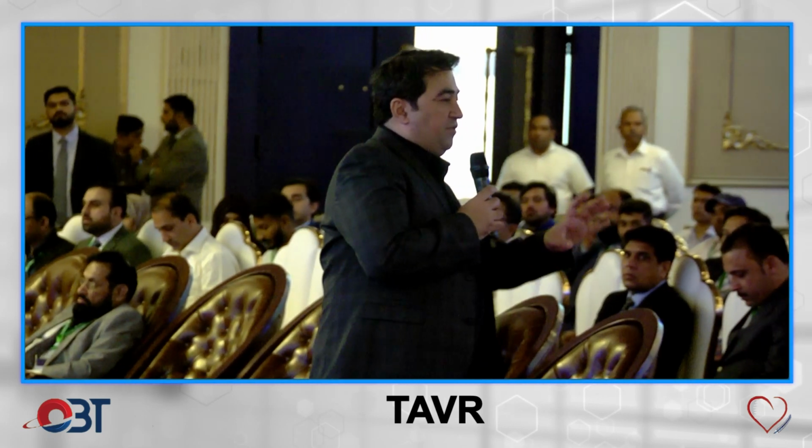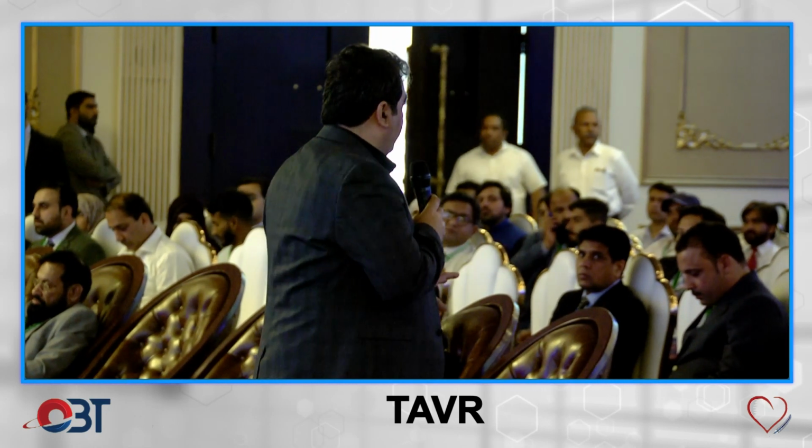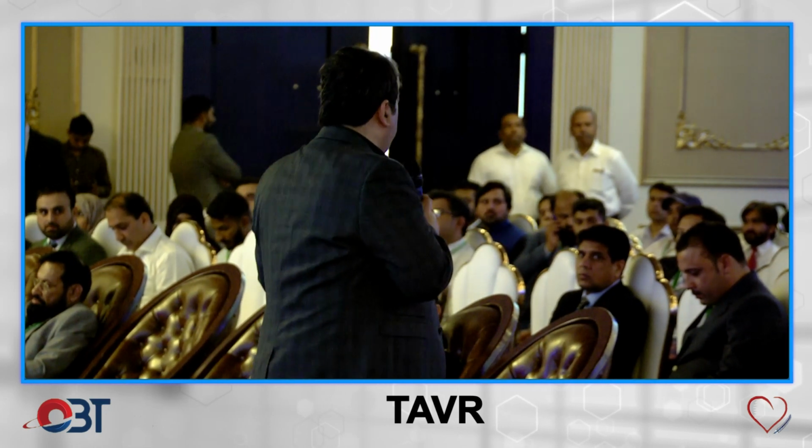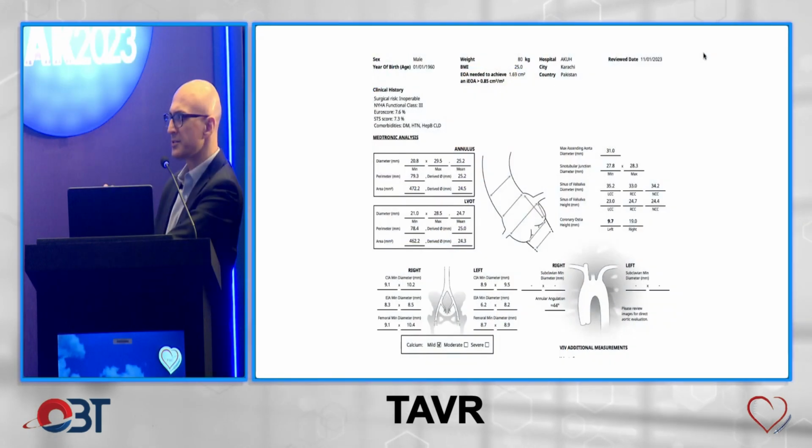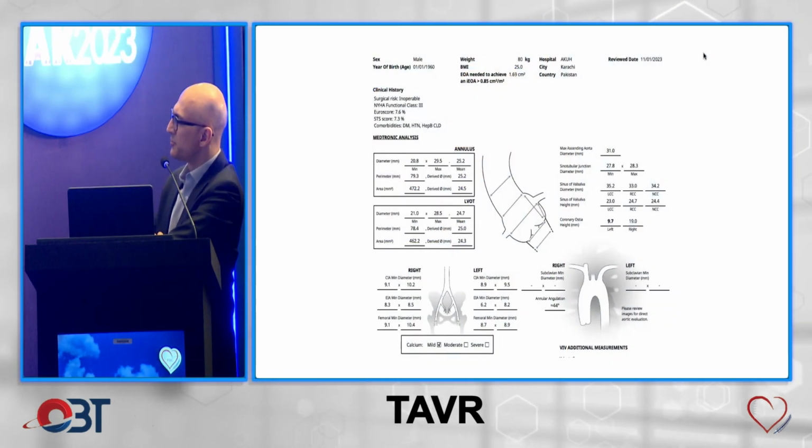तो अगर आपने फ्यूचर में TAVI स्ट्रक्चर का कोई भी प्लान करना है, तो जो फेलोज हैं प्लीज़ फेमिलियराइज योरसेल्फ विद द CT. So if you look at this patient, so generally when you start worrying about coronary heights is at 10 millimeter for all the valves.